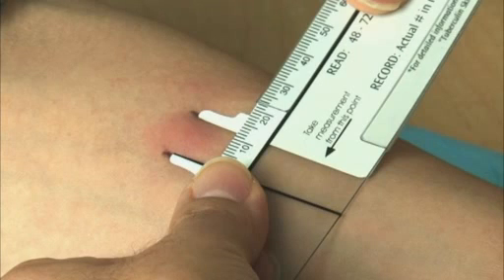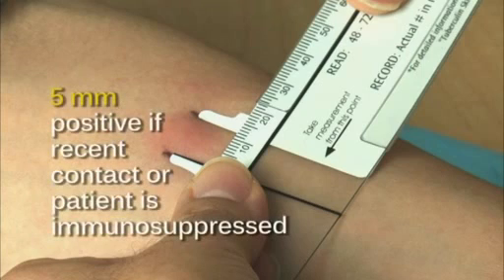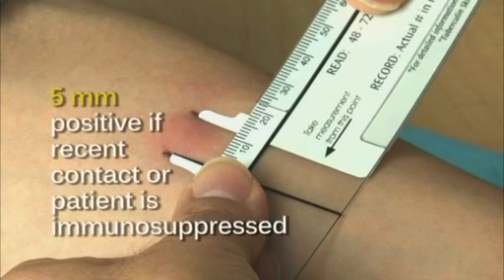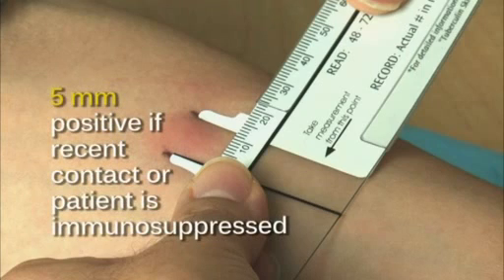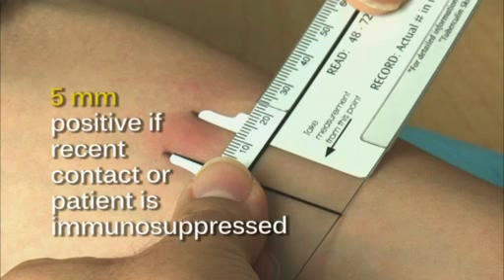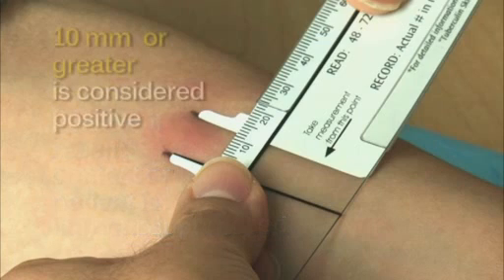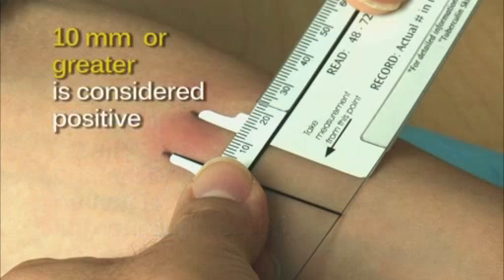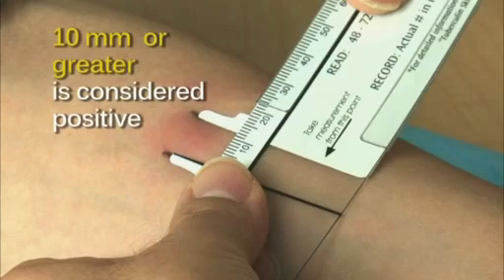Mark and measure the longest diameter across the forearm. A 5 mm reaction is considered positive when there has been a recent contact or if the patient is immunosuppressed. 10 mm or greater is considered positive otherwise.